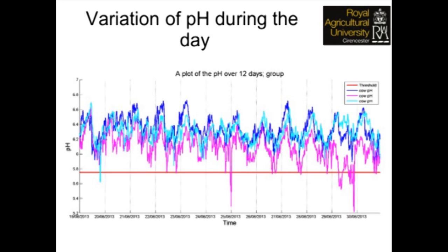Now the profile shows a rise most nights, it climbs up, then about 6 o'clock in the morning it drops down again, and then it bounces along, begins to rise again in the evening. Now that period when it's rising is when the cow is sleeping, or she's not eating. Maybe that she wants to eat but she can't for various reasons to do with management.